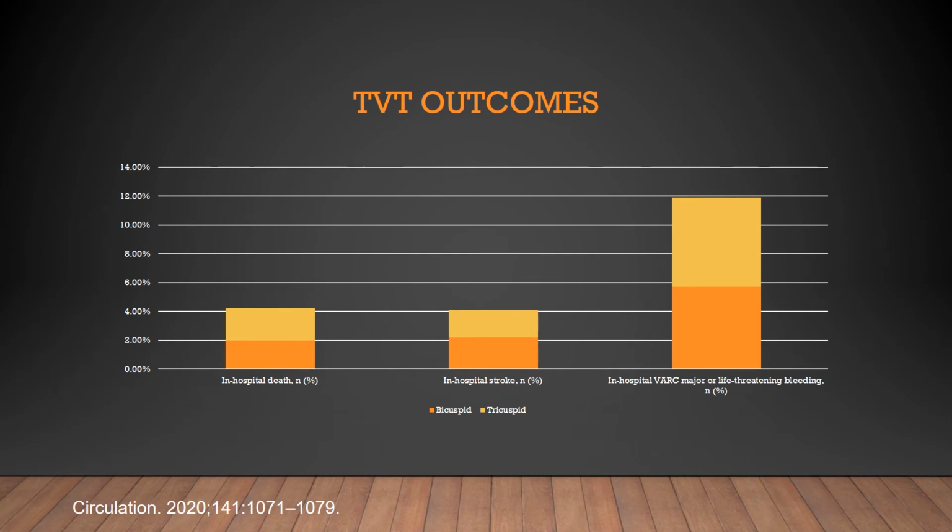Moving on with yet another very new publication from the TVT registry. Again, good news. There was no difference in in-hospital death. There was no difference in in-hospital stroke. Also, there were no in-hospital VARC differences in bleeding, which is very, very good.